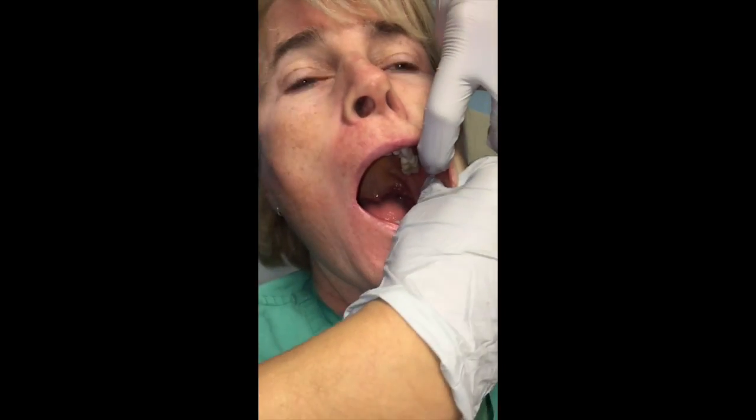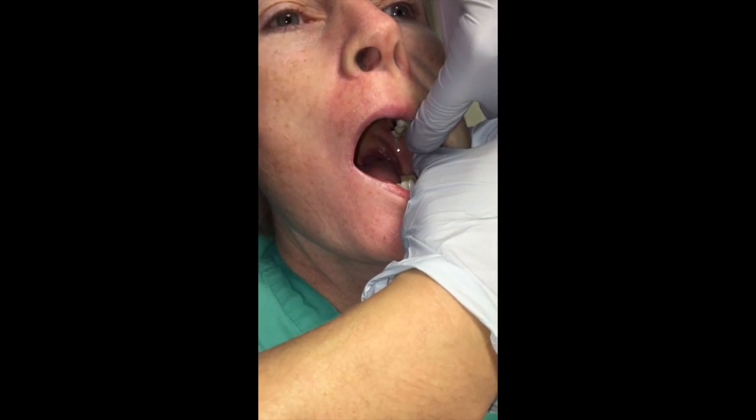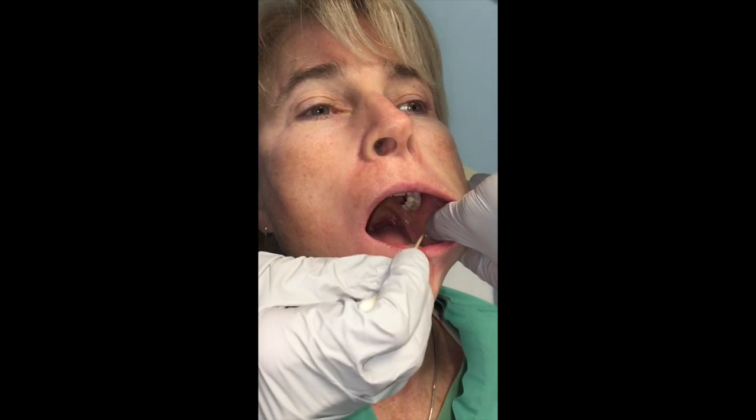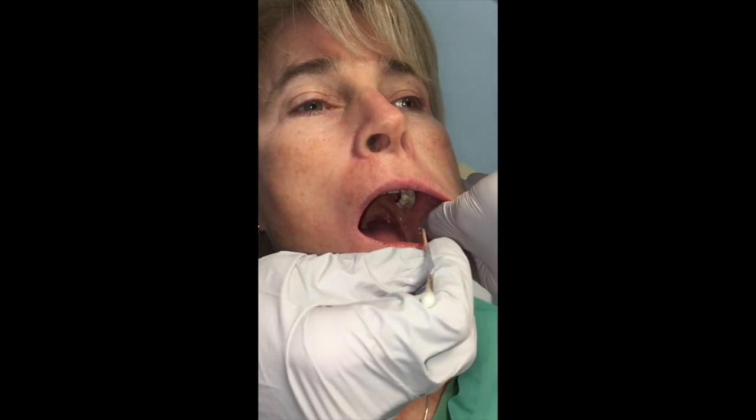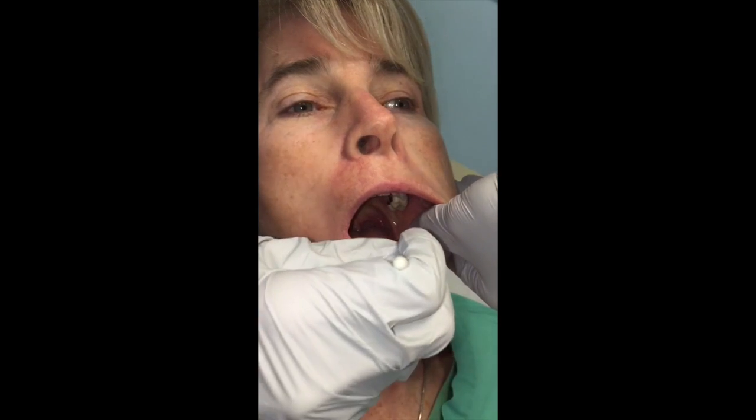You want to palpate for the coronoid process. When we go in with the needle, we want to bisect the thumbnail — coronoid process, bisect the thumbnail right along the occlusal plane, which is the plane of the teeth.